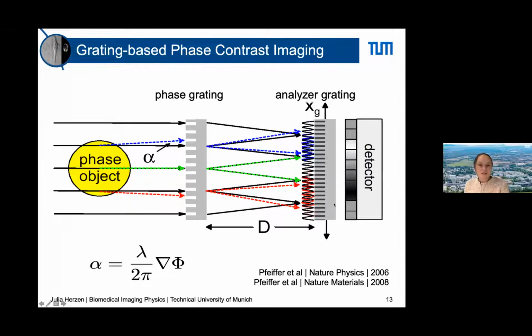Slightly, not to go too much into details, in principle, at the synchrotron, you need an optical element. In this case, it's called a phase grating here. It's a structure which is most of the time etched in silicon. It's a 1D structure, like bars, holes, bars, holes. And these bars are selected such that they shift a special energy coming from the X-rays by a special amount. The phase is shifted by a special amount, adjusted to the design energy, we call it.